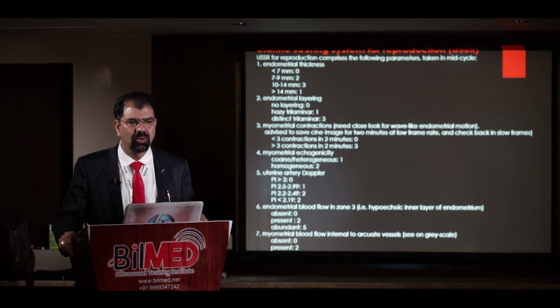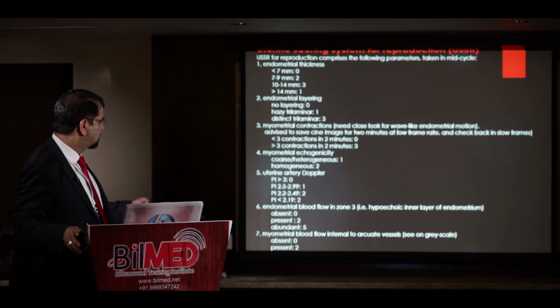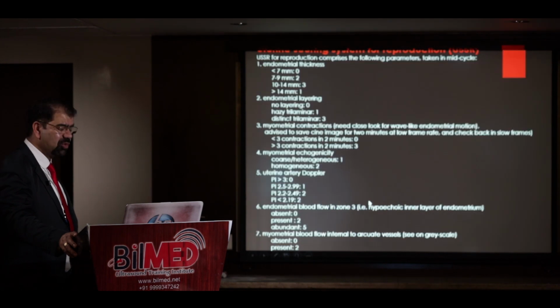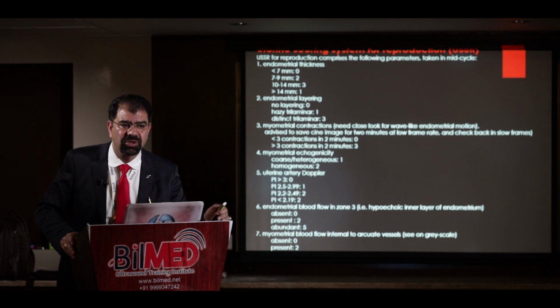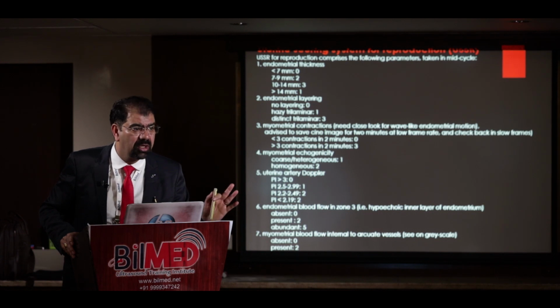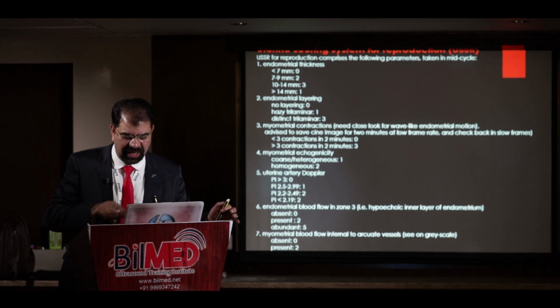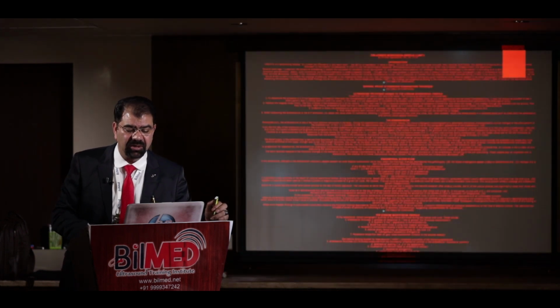Besides the follicle, you have to see for the uterus, and what you have to see in the uterus is the endometrial thickness, the layering, and the flow which is going into it, so that it will get implanted. These are the points which you have to see. I am not here to dictate that you calculate it by your calculator. No, you have to see these details in the uterus. Besides this follicle, please see to the uterus like this, and if you are able to take this and put it in one basket, what will happen?